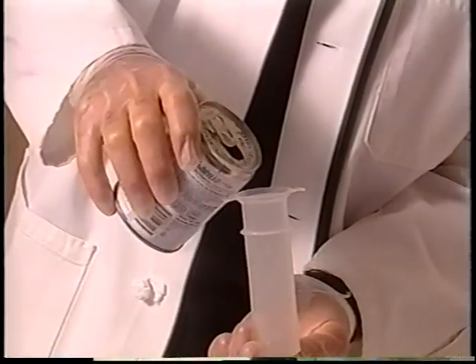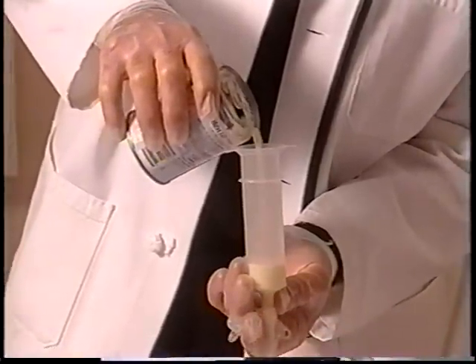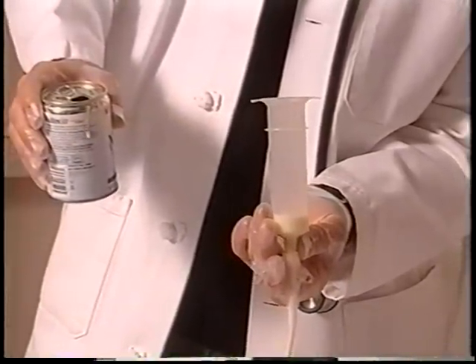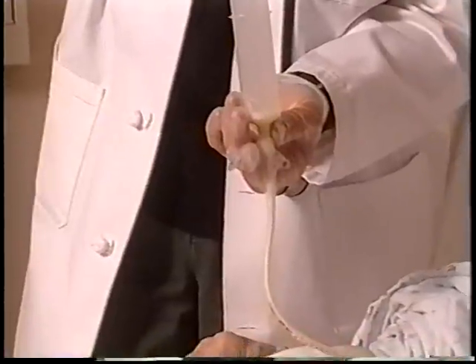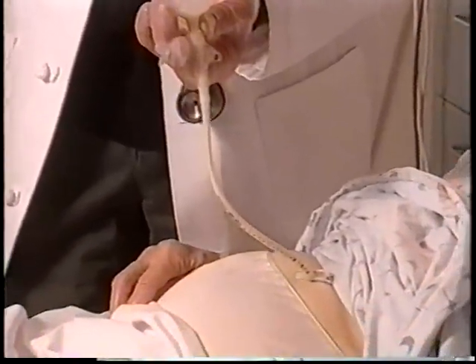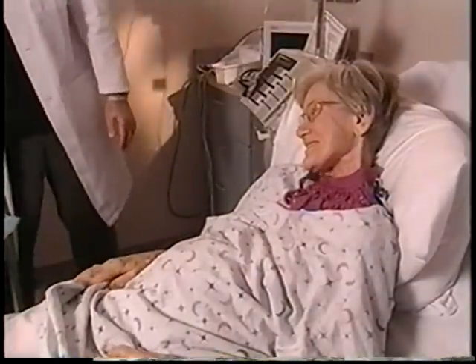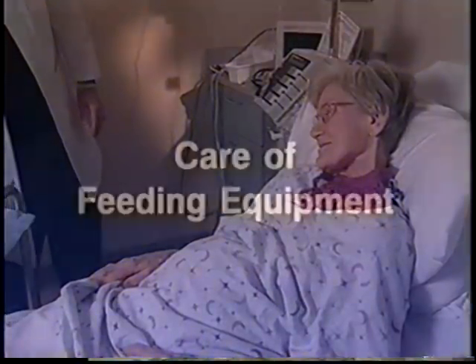With either bolus or continuous feeding, it is important to deliver the formula slowly to prevent the patient from developing stomach cramping, nausea, vomiting with the potential for aspiration, gastric bloating, or diarrhea. Patients, too, will often identify other specific measures which prevent problems. For patients who are immobile, after the feeding is complete, the head of the bed should remain elevated for at least 30 minutes.